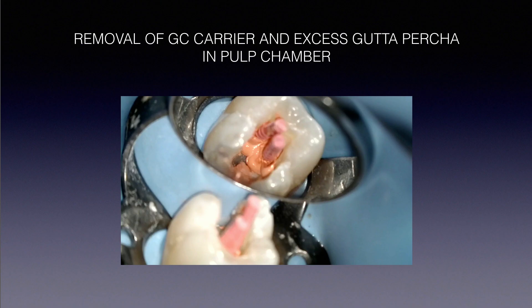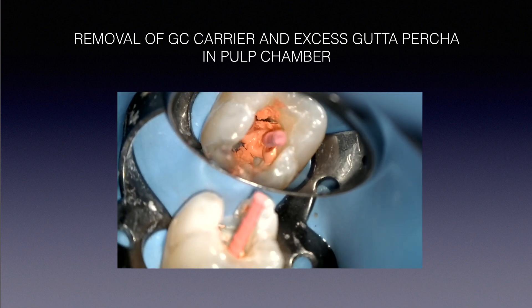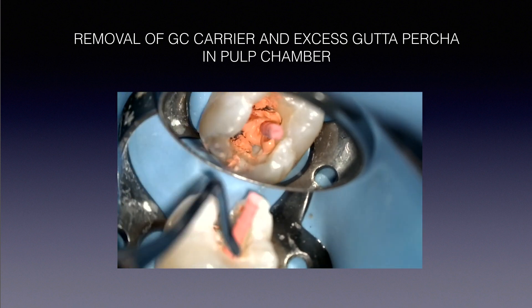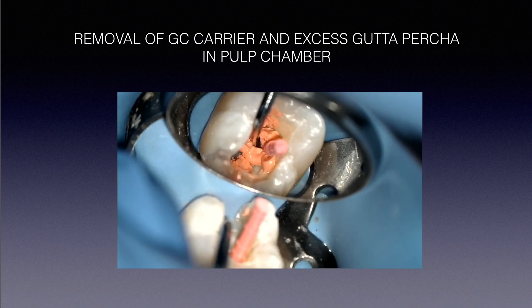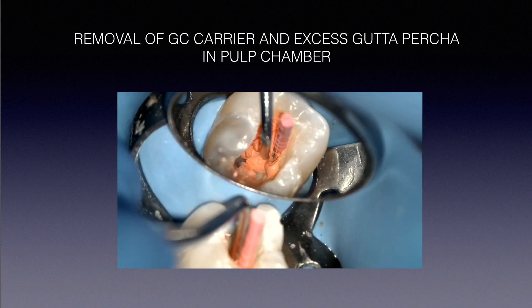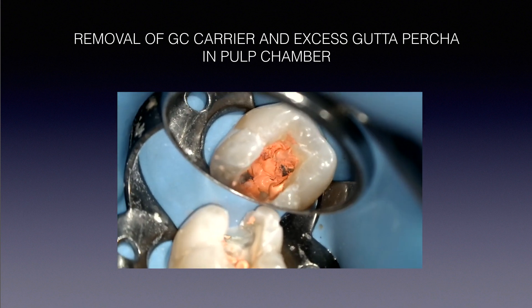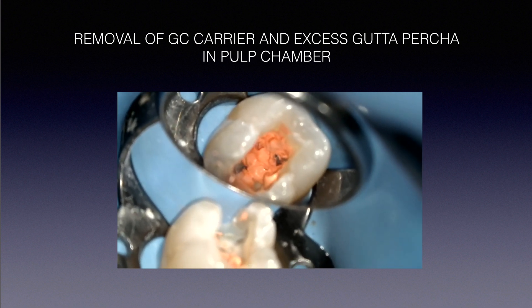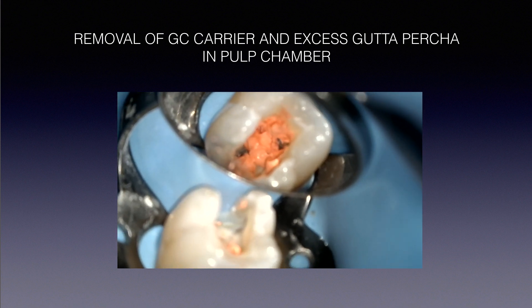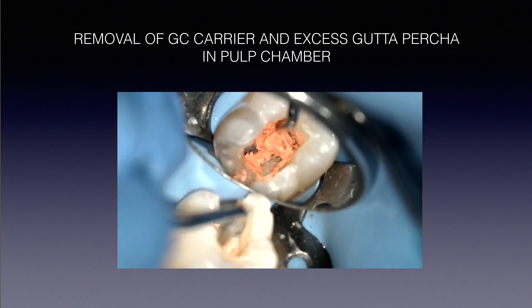Now, how to remove the Gutta-Core carrier from the pulp chamber. It's very simple: use a sharp spoon excavator. Go in at the orifice with apical-lateral pressure and it snaps off. A sharp spoon excavator is essential — if it's dull it won't work easily. I don't recommend a hot instrument or a high-speed bur. Just let the excess gutta-percha cool off naturally, or blow a little air from your air syringe, and it'll be cool enough to flake off easily.